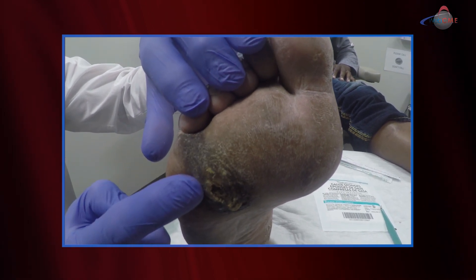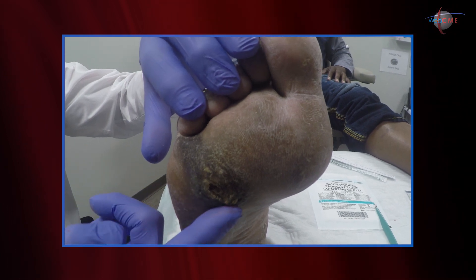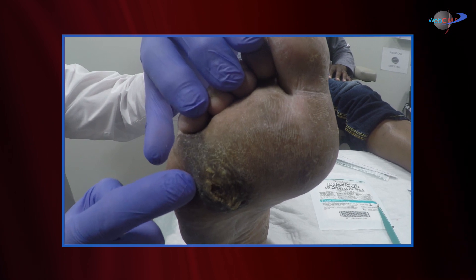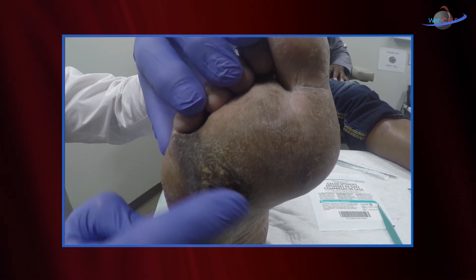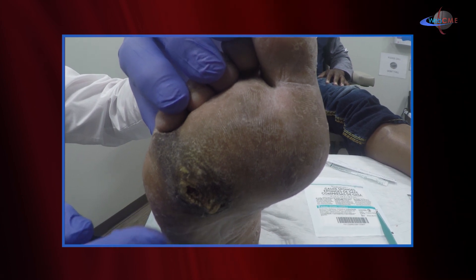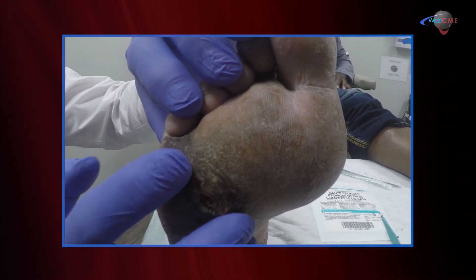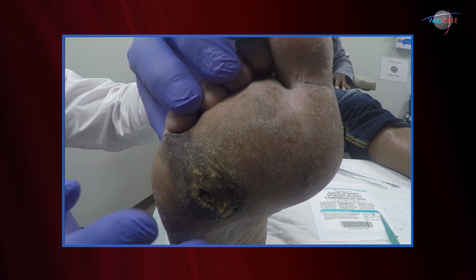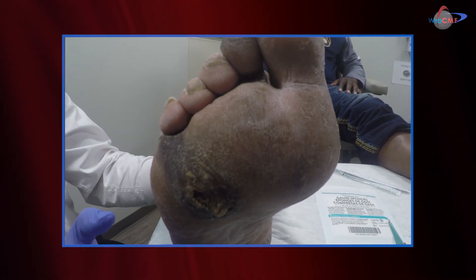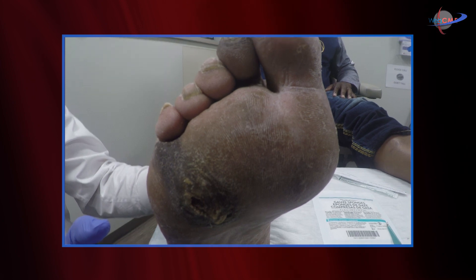Callus can be a problem for us. Not only does it progress in size and depth, but we can get hemorrhage underneath the callus and frank ulcer formation. We're going to explore this callus a little bit to determine what type it is and what depth is associated with it — to determine if there is an ulcer, and if so, what type of ulcer it is.